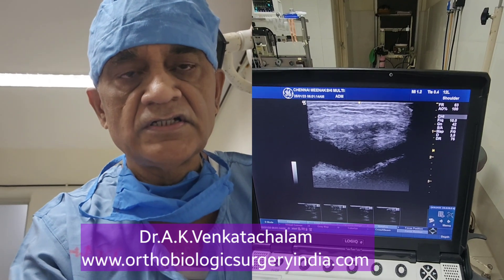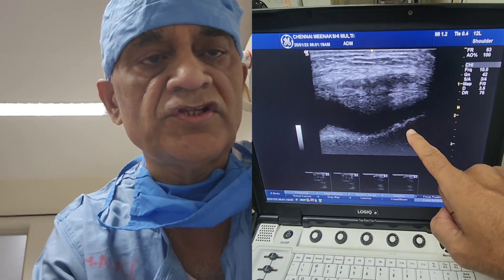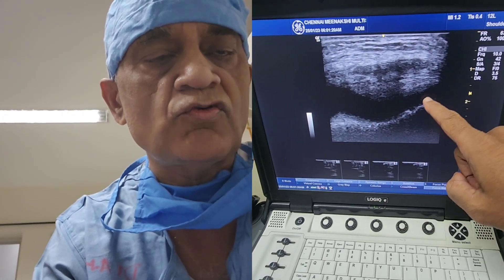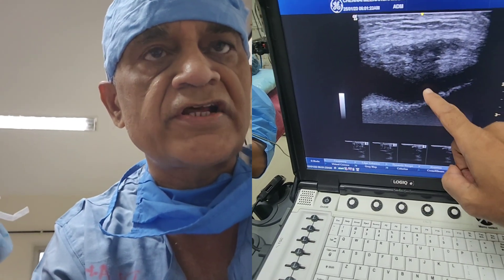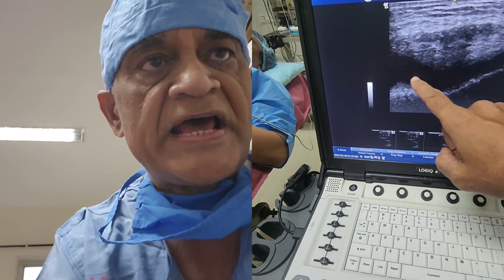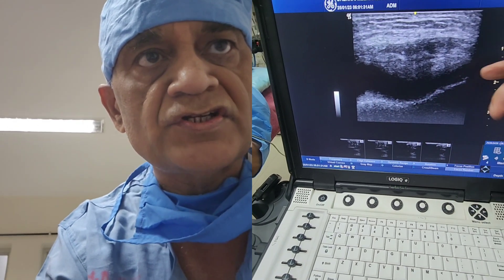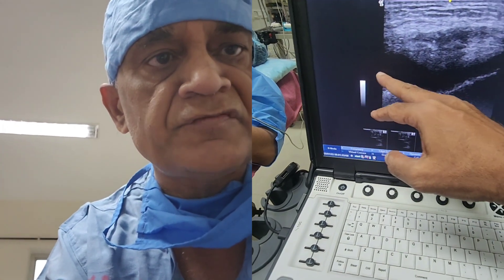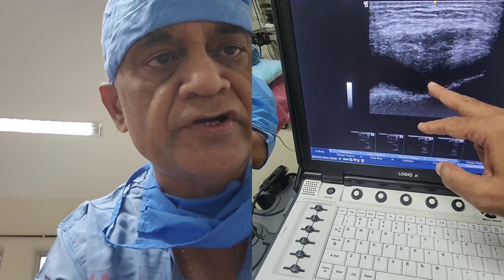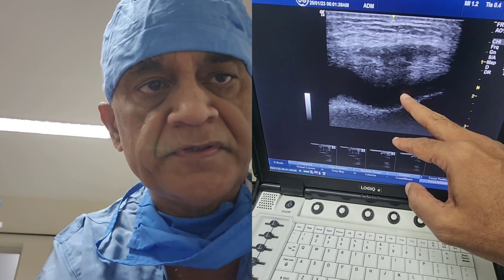The patient is here and this is the ultrasound appearance before the procedure. This is the outline of the femur bone or trochlear. This is the outline of the patella bone, and this black area which you are seeing here is the effusion. There is plenty of effusion. I will be inserting a needle from here, withdrawing this fluid and injecting stromal vascular fraction and PRP.